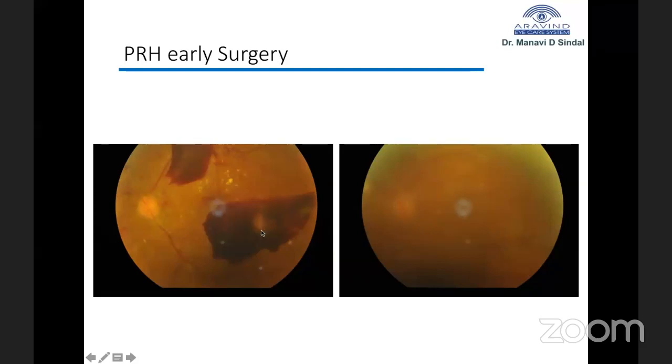And if you look at this particular eye, you see this whitish spot. This is a neovascular front or a locus over there. So when you laser the periphery, this neovascularization starts regressing, and this blood and the taut hyaloid give impetus, like a scaffold, for the fibrous membranes to proliferate. If you see the patient after 2 months, this blood clot will be almost looking the same. Then somebody might think, oh, it's still there, and may add more laser. And as you keep doing that, the periphery keeps getting lasered, and the posterior pole keeps having more and more fibrous component developing, with the underlying retina developing more and more traction.